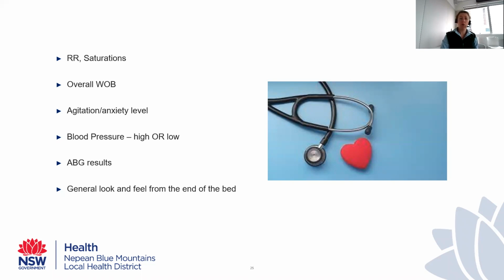So blood pressure, high or low, and I say that in terms of its relativity to the patient. They don't need to meet MET call criteria, but if there's someone who normally has a systolic of 160 and now they have a systolic of 120, that's worth noting. So I guess just remember back to earlier in the presentation, PEEP has consequences on hemodynamics. High pressures have consequences on hemodynamics. It's not something we should ignore.